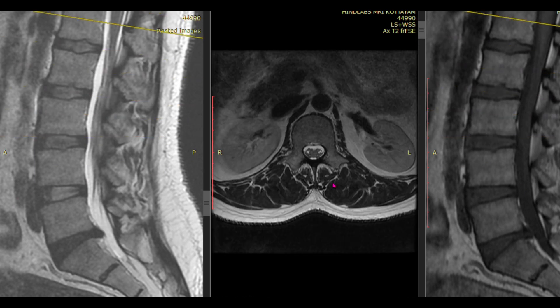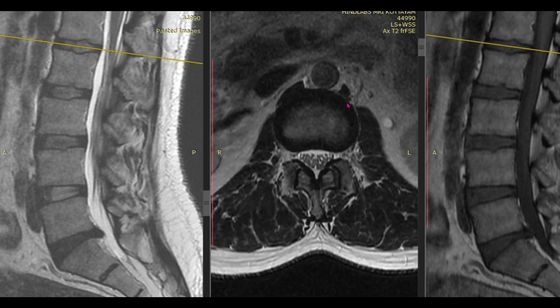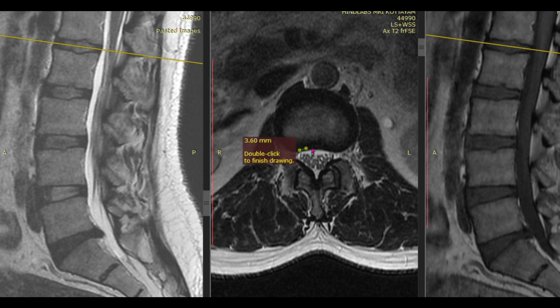In axial sections you can much more clearly see the peripheral annulus fibrosus and the central nucleus pulposus. Importantly, there is a normal posterior concavity of the disc which should be maintained in all cases. If it is not there, that means something is abnormal. This concavity should always be present.